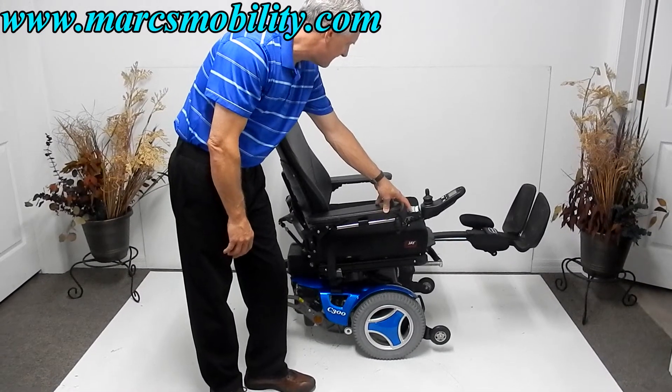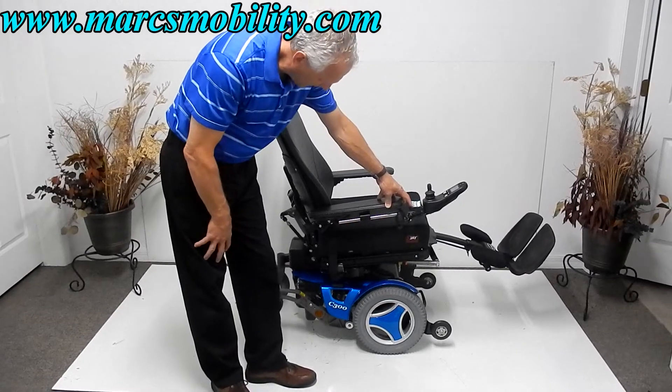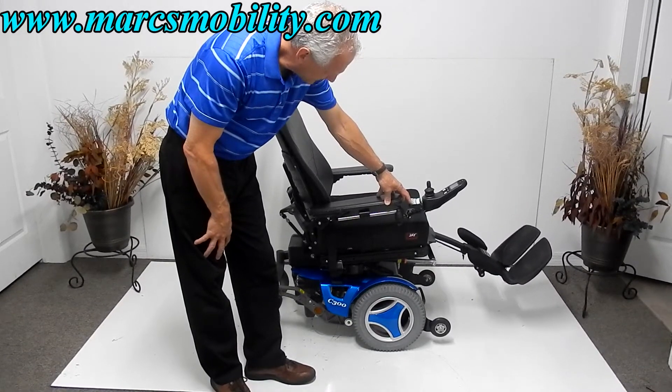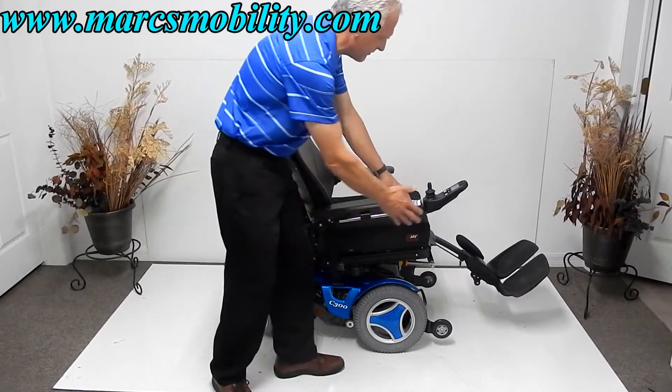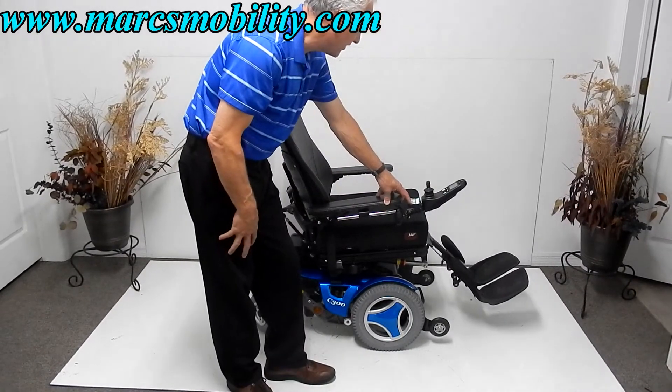This is your electric tilt coming back and the electric legs going down. Very nice chair. The joystick can also be transferred from the right to the left, depending on which side you need it on.